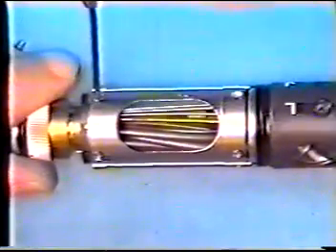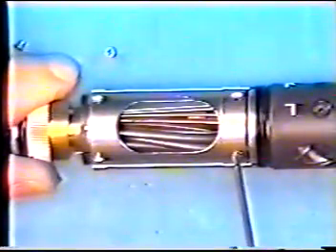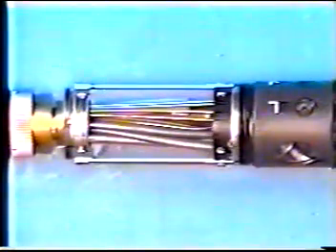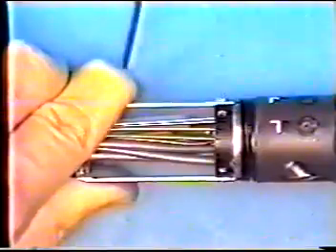Disassembly of operating section part 2. Extract LG from operating section. Remove another joint cover. Remove 4 screws which secures operating and inserting section.